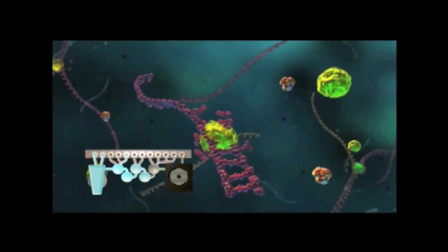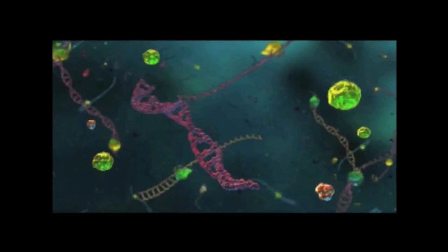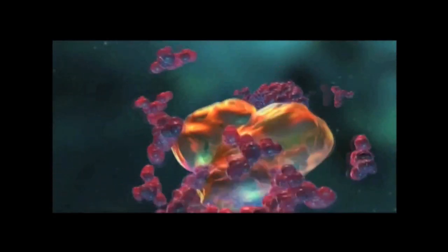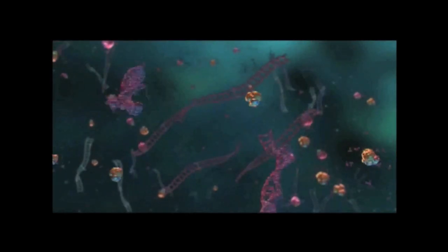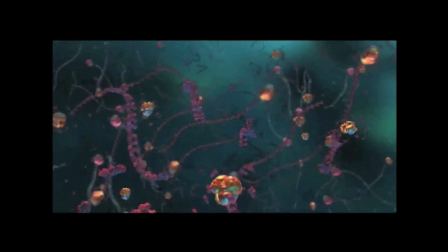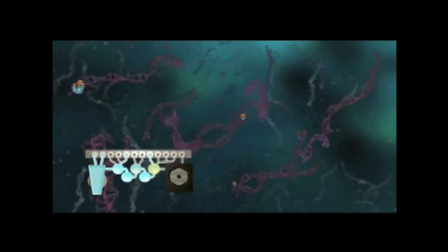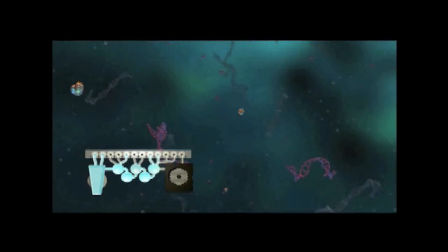A reverse transcription step is performed to convert any target RNA into DNA. This is followed by a high-order multiplex PCR involving dozens of primer pairs. During this first stage PCR, many reactions simultaneously occur in this single large volume reaction. The products from the first stage PCR are then diluted to limit any remaining first stage PCR primers.